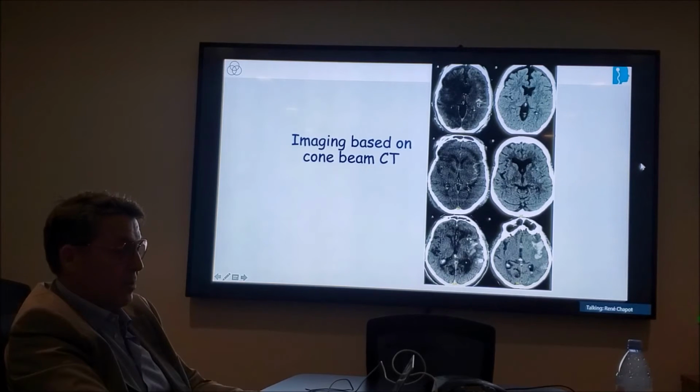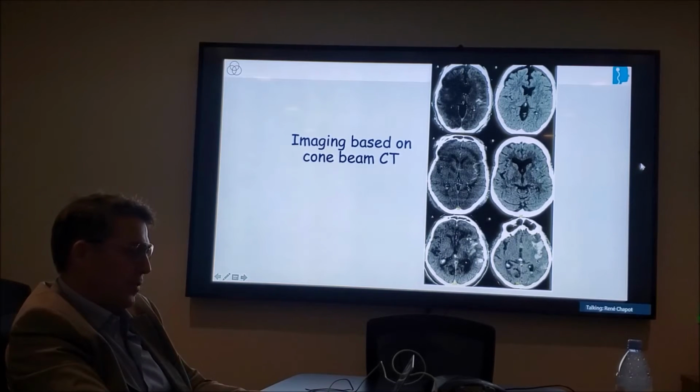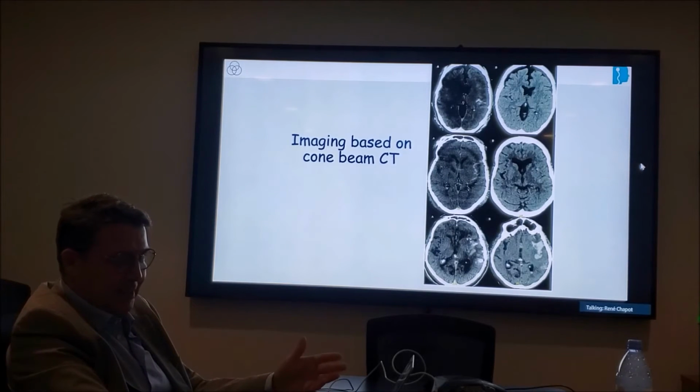Next day is normal. Here is SAH, where next day you can see a bit of blood, but this is minimal. And here we call it hematoma, where we have a more significant amount of blood. But in the end, the prognosis of those patients is usually related to ischemia and stroke, and most of the bleeding cases are luckily not relevant.